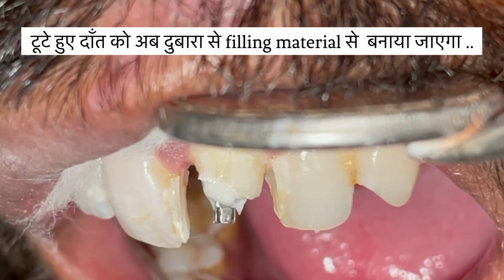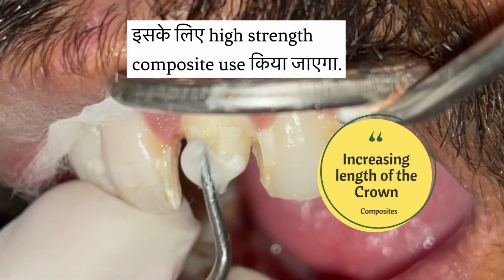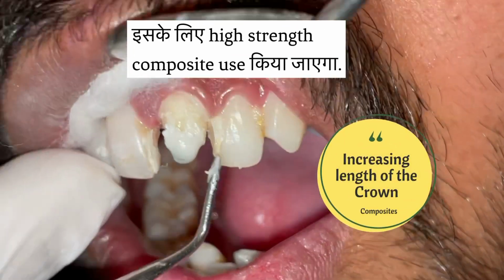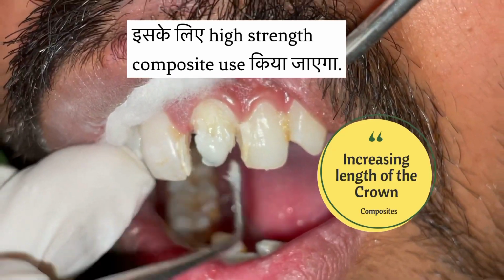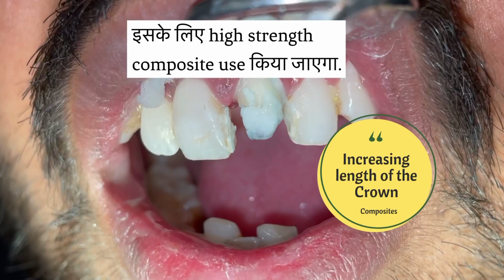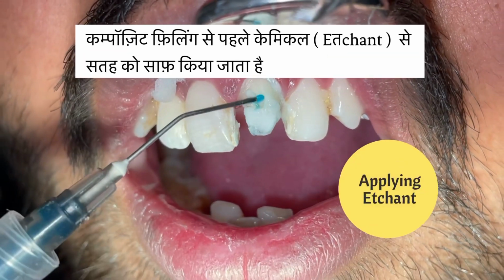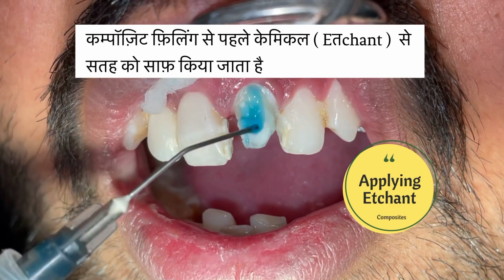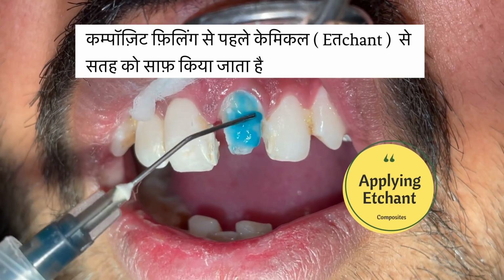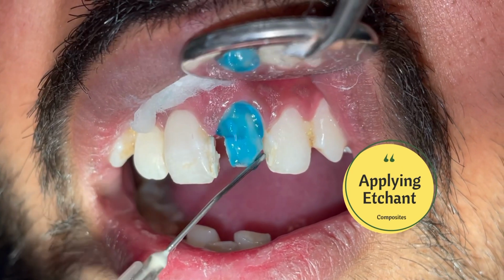As you can see, the post is already placed inside the tooth. Now we'll be building the tooth crown accordingly. For that, we'll use a special material called composite. We put that material and cure it with the light cure gun, and within a couple of seconds it sets on the tooth surface. For that, we'll start with the first step. We put a chemical agent called etchant on the tooth surface, which makes the tooth surface rough enough for better adaptability of the composite material.